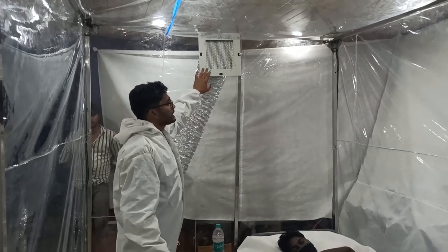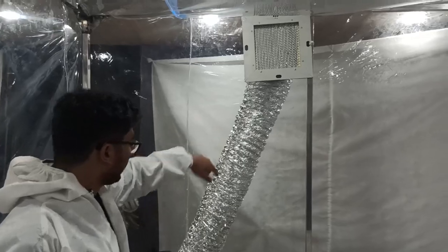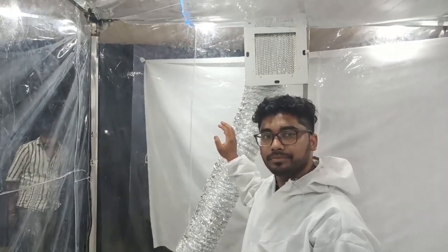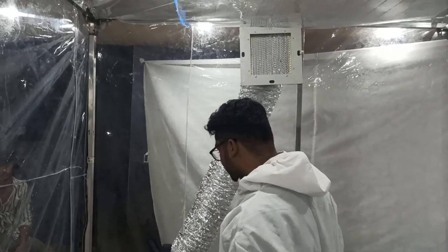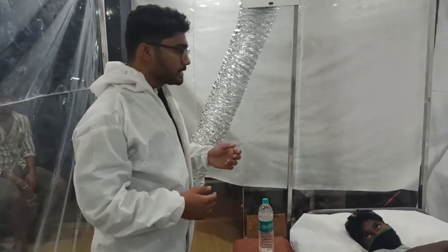The air is sucked out through this HEPA filter via the pump, which creates the negative pressure. This HEPA filter removes 99.97% of the contaminants such as suspended droplets and particulates, and therefore the exhaust air is completely safe and has no chance of infecting a healthy person.